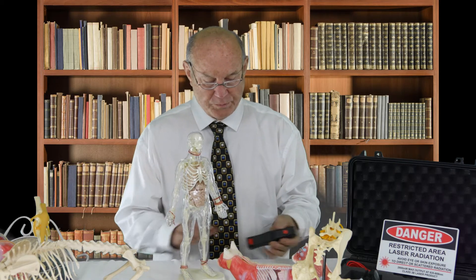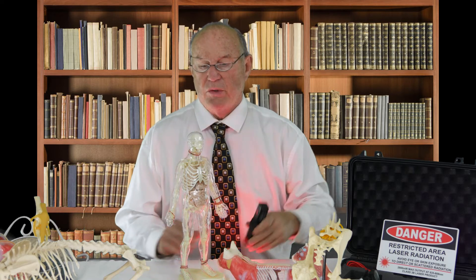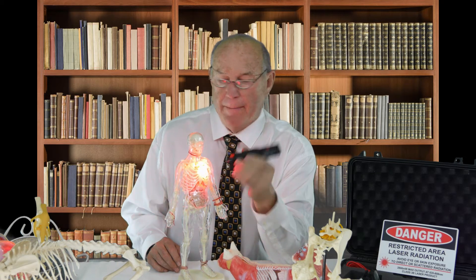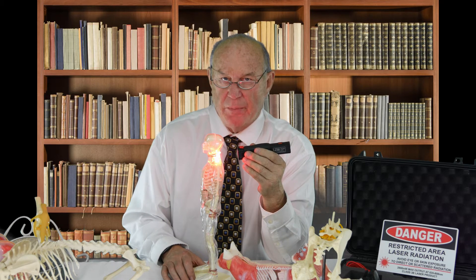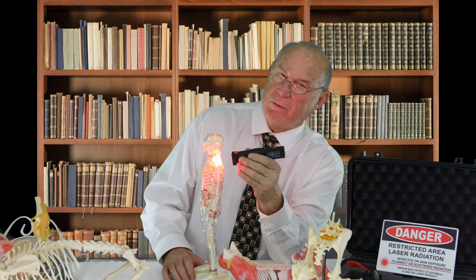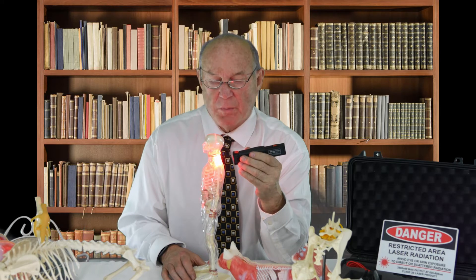First, we'll laser about 20 to 30 percent of the shoulder with the neck pain spinal subset protocol. Remember that this is not just for pain — it rehabilitates the actual tissues of the spine. The red light actually rehabilitates spinal tissue, and that's why we use pain subset spinal.